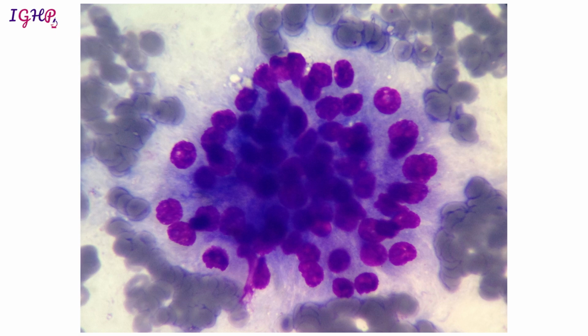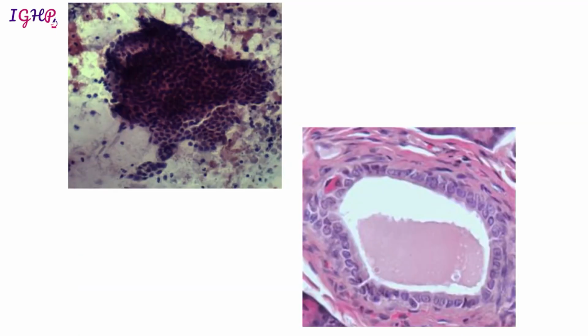In an acinic cell carcinoma, the cells are going to be hyperchromatic, though they will still retain this acinar structure. They are going to be much more numerous, so there will be sheets of these cells, and you do see prominent nucleoli within the acini. So that is acinic cell carcinoma. Otherwise, the normal pancreatic acini will be occasional, and they will be similar appearing without the nucleoli.